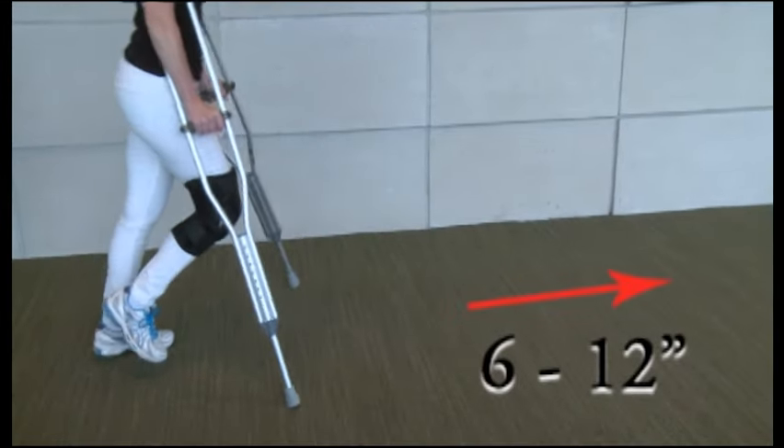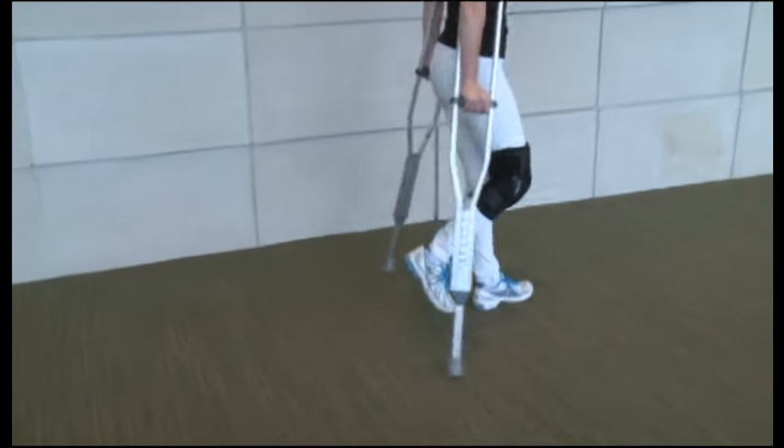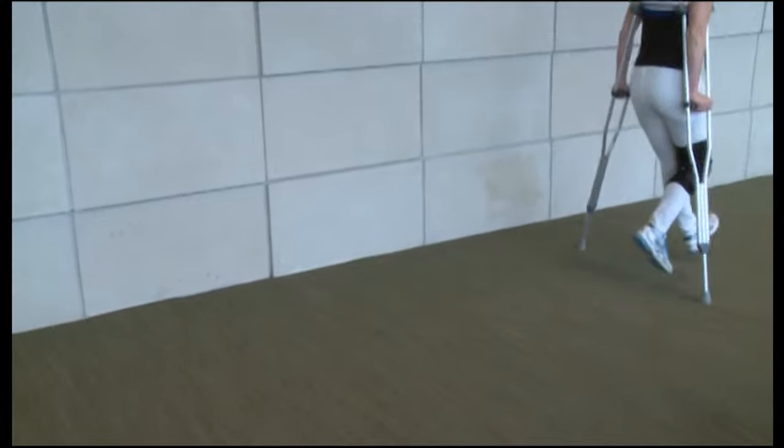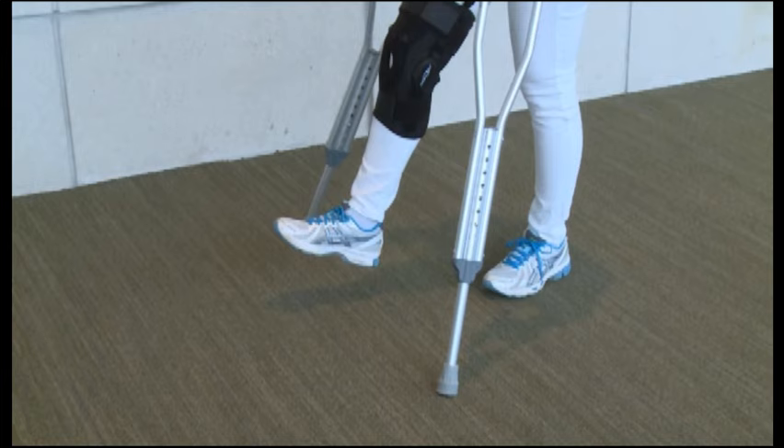Move the crutches forward 6 to 12 inches. Push down on the hand grips as you step forward, holding your injured leg out in front of you. Or you may bend at the knee of your injured leg if that is an option. The tips of the crutches and the healthy leg should always form a triangle — this will make you steadier and less likely to fall.